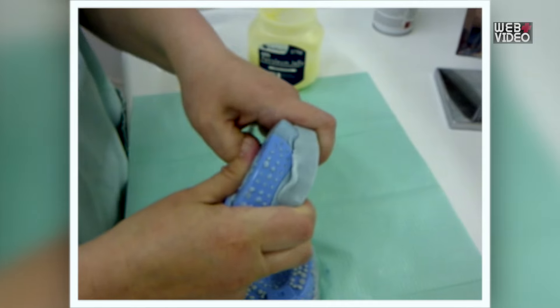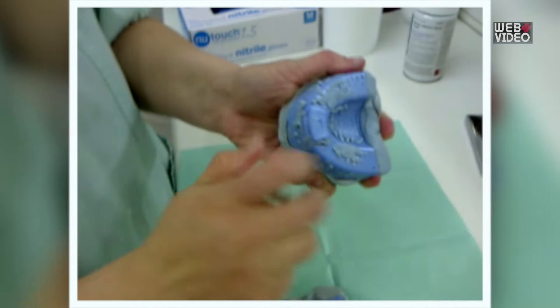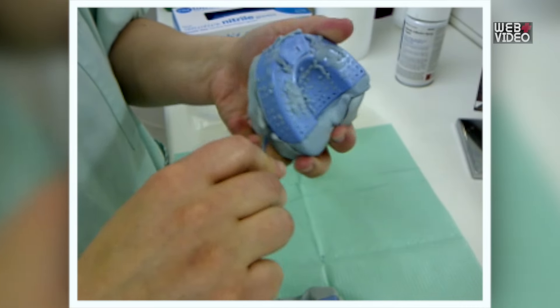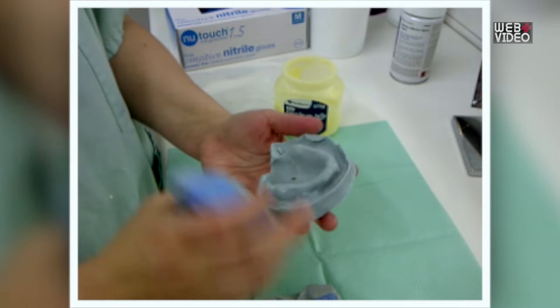Step 3: Wait for the mixture to harden, then separate the two halves. You may use a butter knife to help you remove your denture from the putty. Small holes and such are not a cause for concern.